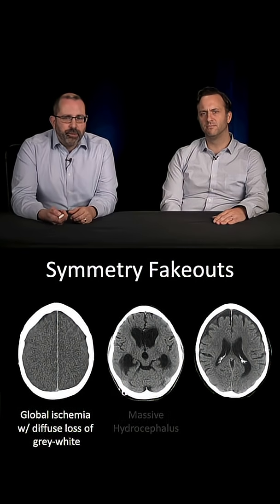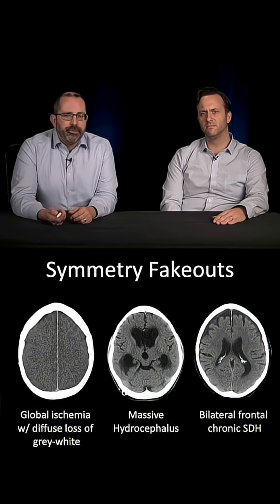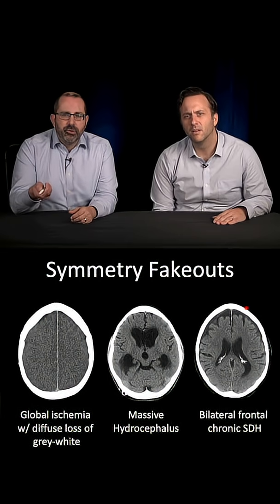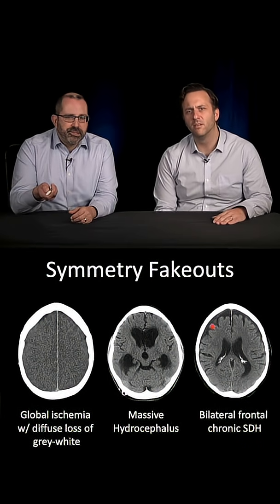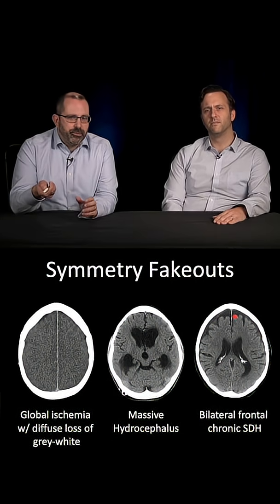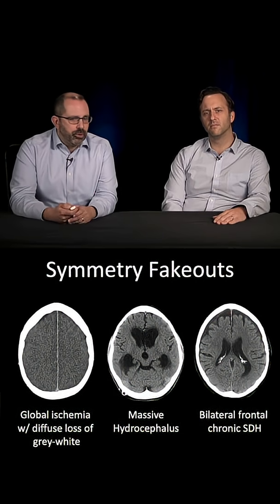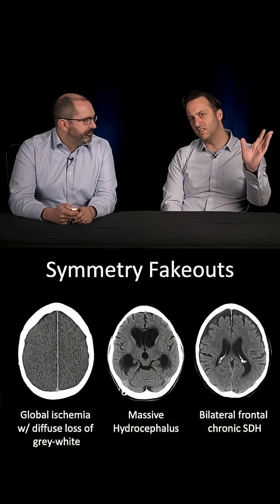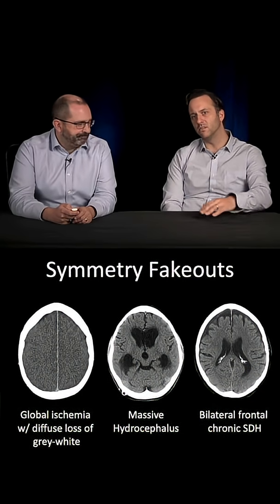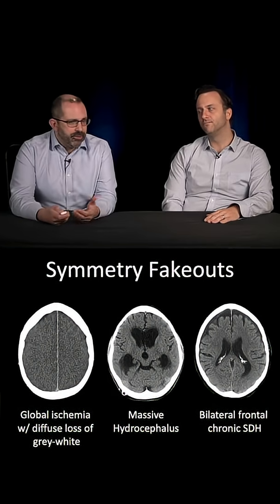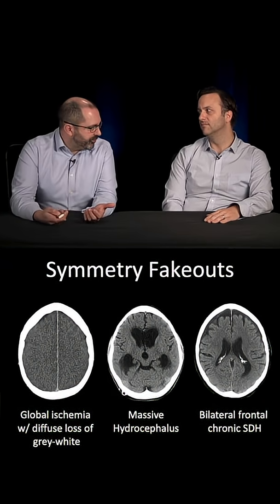And then the case on the right, if you look in the front, these are actually chronic subdurals. It's not CSF density — they're sort of mass-occupying. Those are bilateral chronic. I could totally see myself passing by those on first glance because of the symmetry. And again, it's not always our friend.